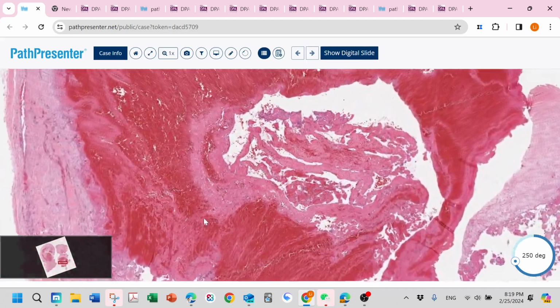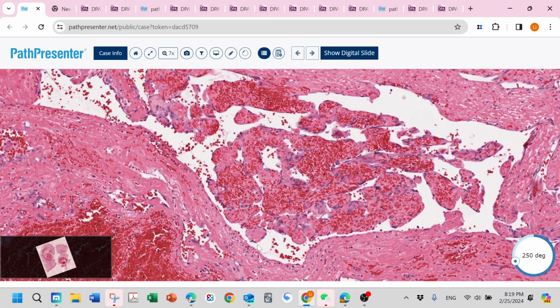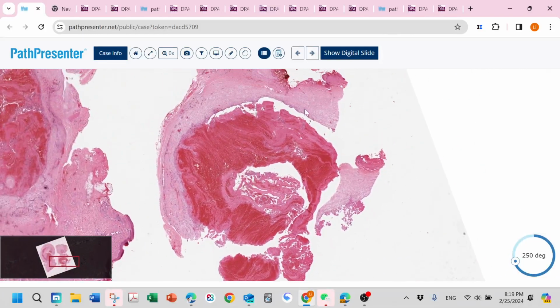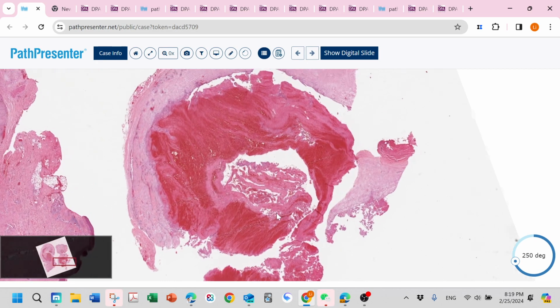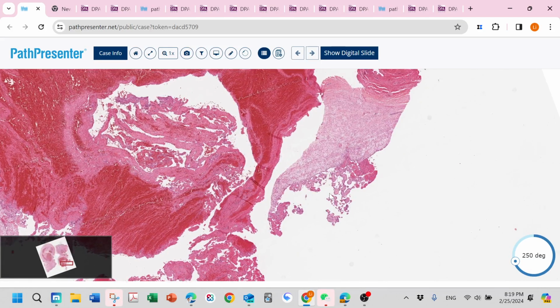So when these endothelial cells grow inside this thrombus, you can see this papillary structure, but this is truly benign because you can see all the endothelial cell proliferation is bland looking endothelial cells. And a good feature is that you see a big dilated vessel, and all of these papillary structures just grow inside. They don't have an infiltrative border, so that's a really good sign for this papillary endothelial hyperplasia, Masson tumor.